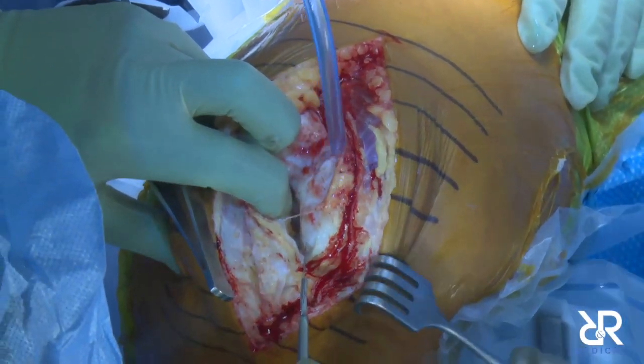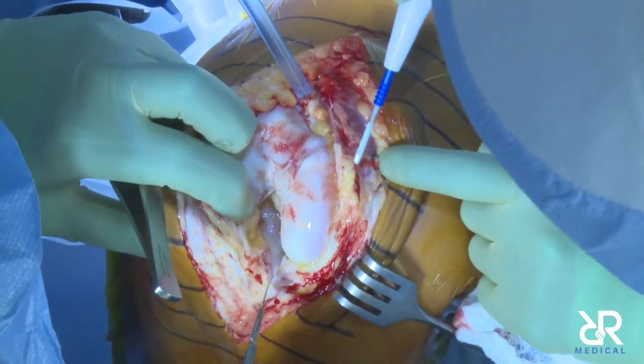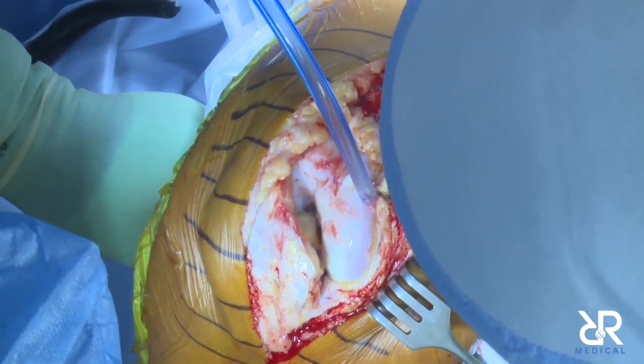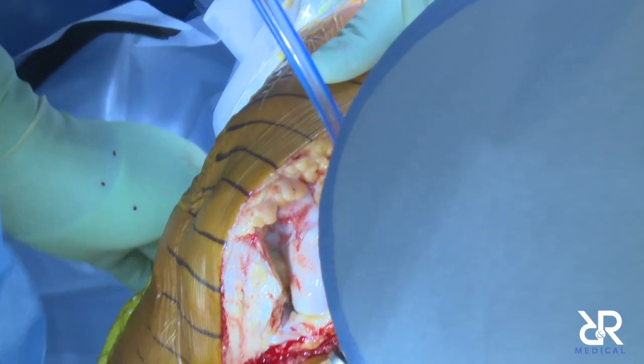I do believe that robotics may play a role in that in the future, where you can say, okay, since I can't see very well, I'm going to do a better job with a robotic solution to prepare the bone properly.